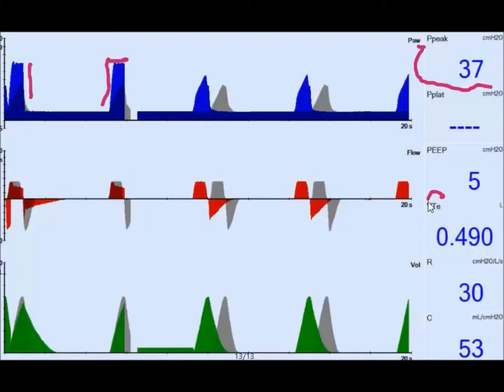However, it had very little effect on my tidal volume, because it didn't prematurely end my breath. It was for the same inspiratory time. My flow starts to accelerate, and I don't have that low tidal volume. So with a dual targeting scheme, it may reduce these incidences of premature cycling, or it might be a little more comfortable for the patient. So that's one thing to consider.